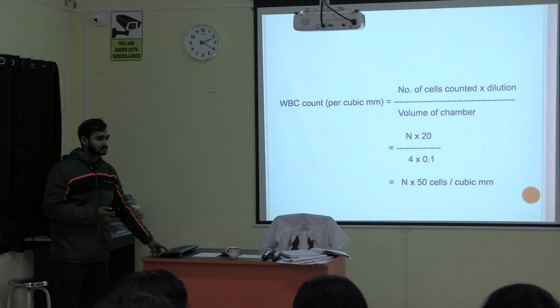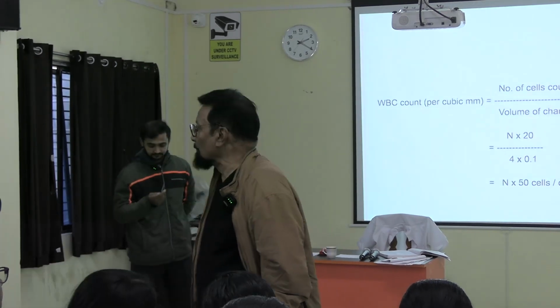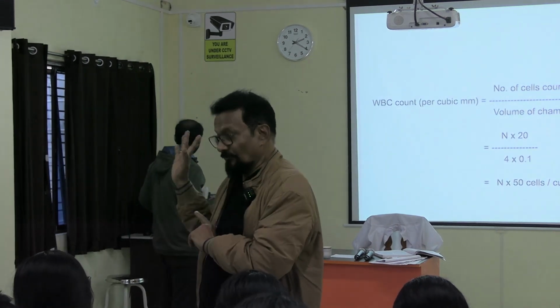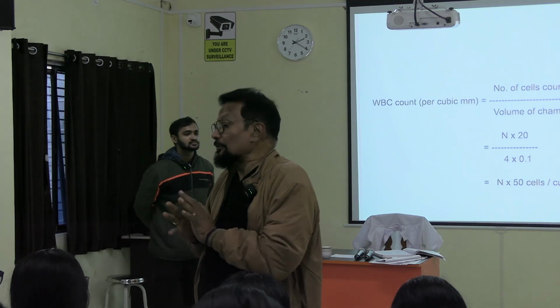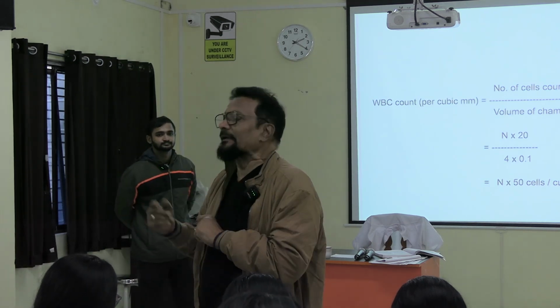Dipankar, Sir. During exam, we may not ask you to calculate all the 4 boxes. We may ask you to count only 1 large box, 1 box instead of 4, then you calculate. Because you are 50 students, more time will be required. So from 1 box you will be calculating.